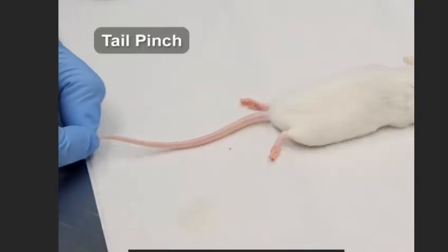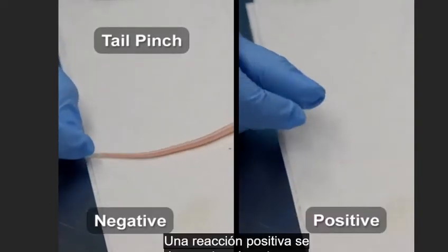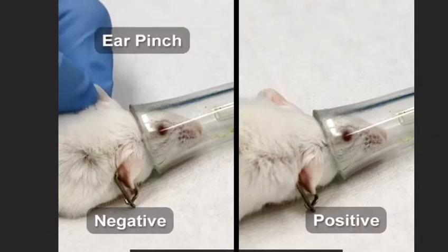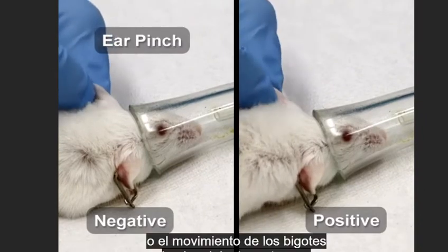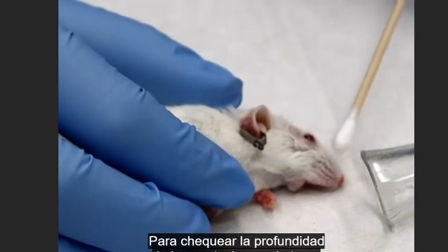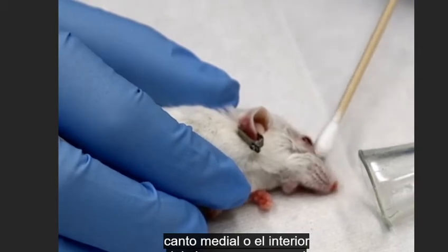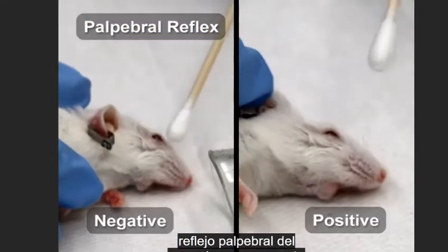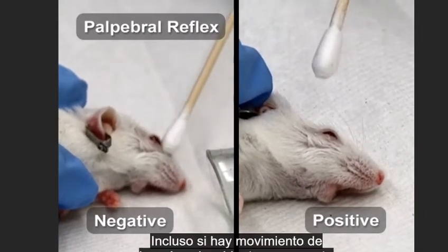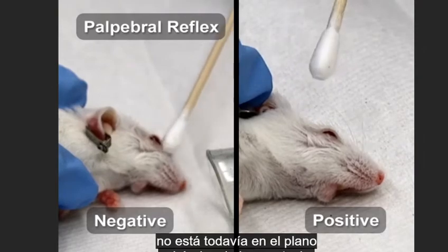Another method is the tail pinch, performed at the tip of the tail — a positive reaction is demonstrated by twitching or tail movement. You can also pinch the tip of the pinna; if there is shaking of the head or movement of the whiskers forward, the animal is not in the surgical plane of anesthesia. To check anesthesia depth, one can also touch the medial canthus — the inner corner of the eye — to elicit the palpebral reflex, indicated by a blink in response to touching the eyelids. Even if there is movement of the eyelids, whiskers, or a marked increase in respirations, the animal is not in the surgical plane of anesthesia.